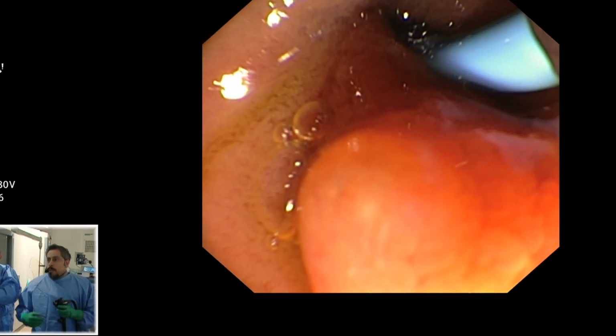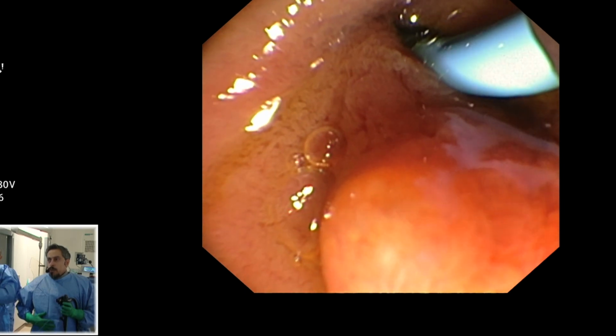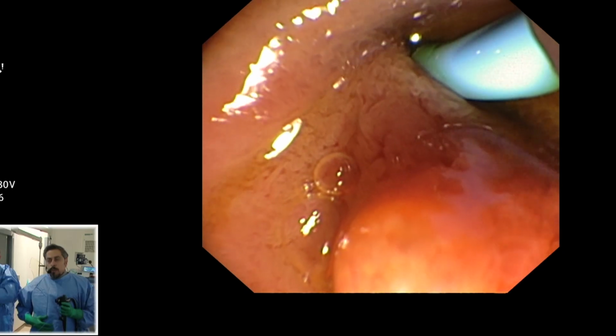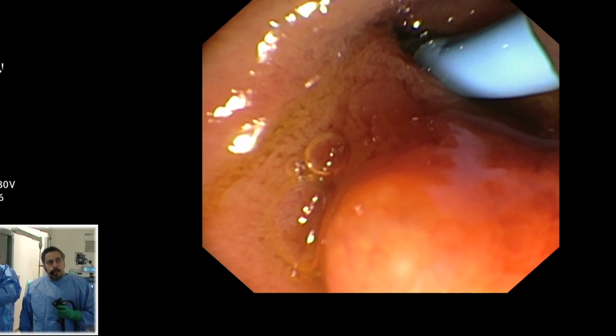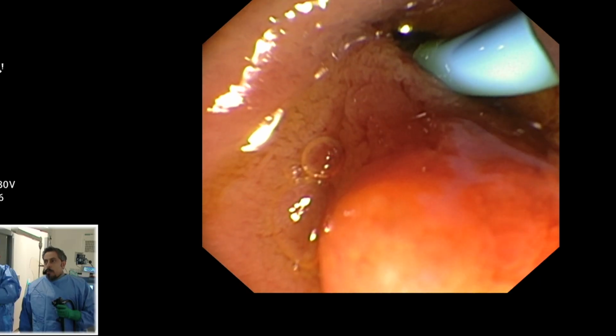So this is a 33 years old who had multiple ERCP and actually had probably one or two cholangioscopy in the past. He had previous cholecystectomy, so he's probably a stone former. He had multiple stone formation, and now we had this what looks like a stone in the common hepatic duct.